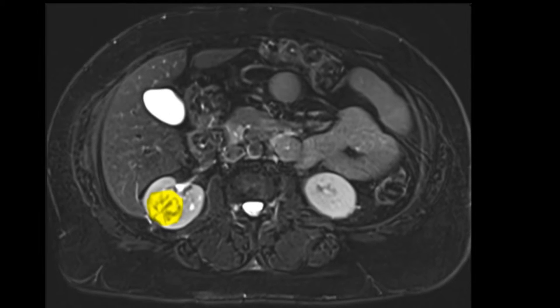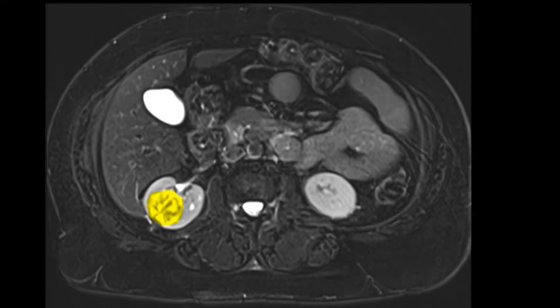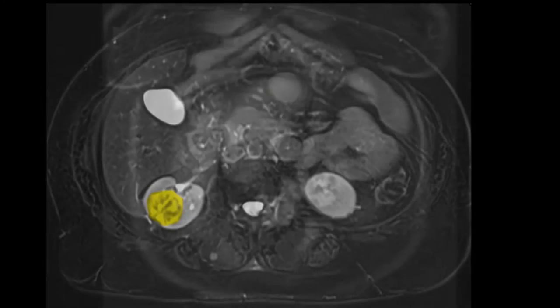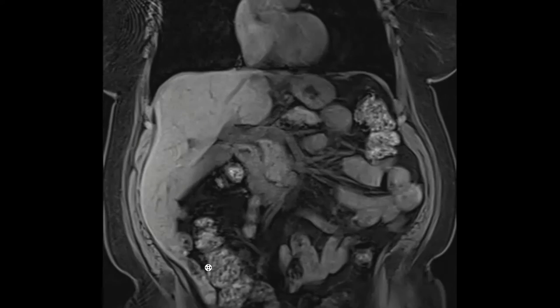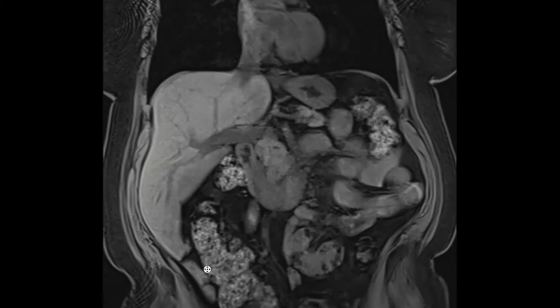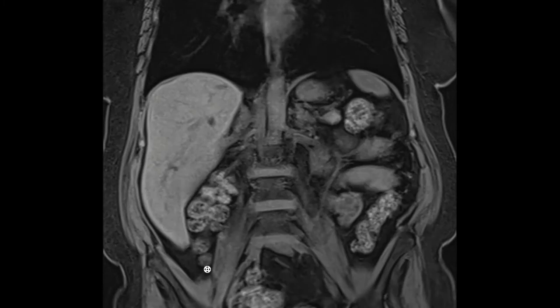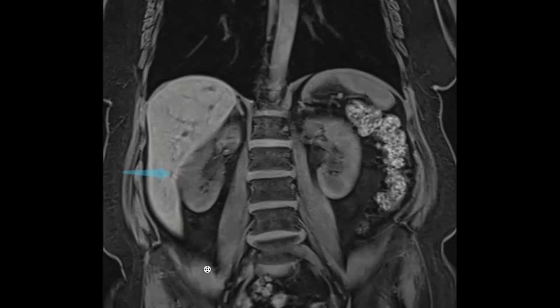Although a very reasonable indication for partial nephrectomy, it is in a patient that's had prior surgery on this kidney, so I think it'll be an interesting educational video. Here's a coronal view just showing you the vasculature and the tumor itself.